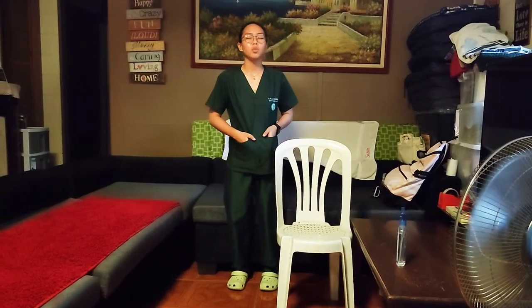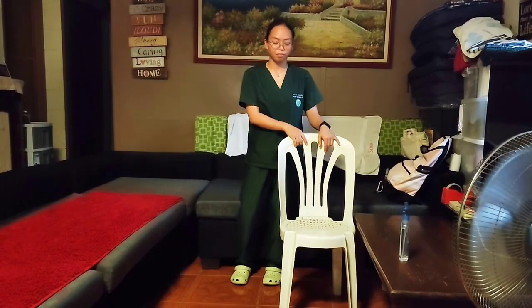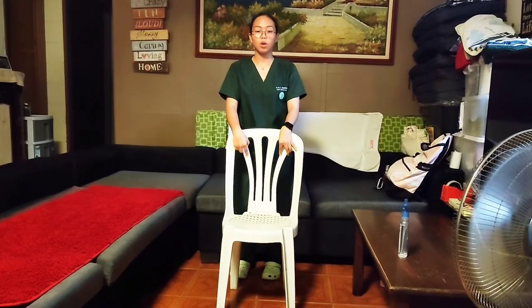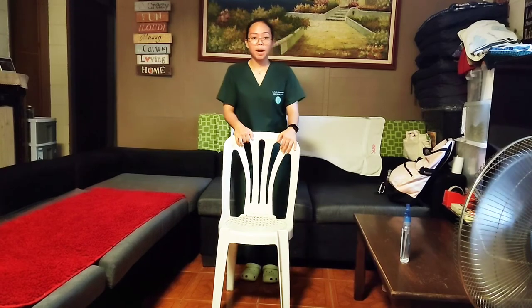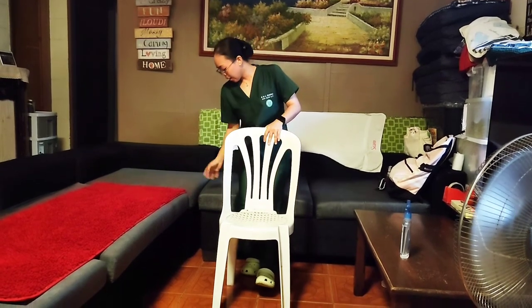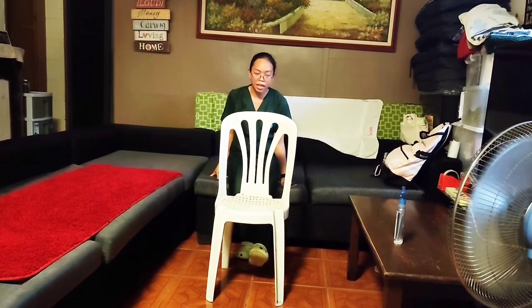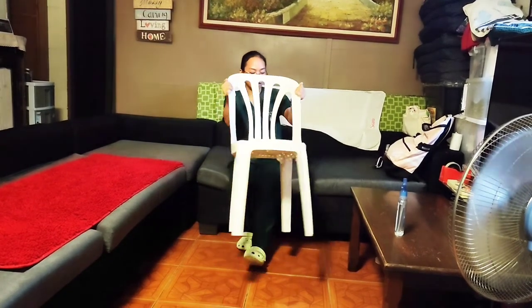If the patient wants to sit down in a bed or chair, place the walker in front of the patient and help them sit. Bend the stronger side first, then elevate the weak side. Assist the patient to reach back and hold the sofa or chair, then bend the stronger side and proceed to sit down. If more comfortable, set aside the walker.